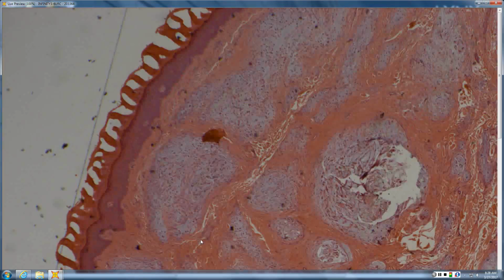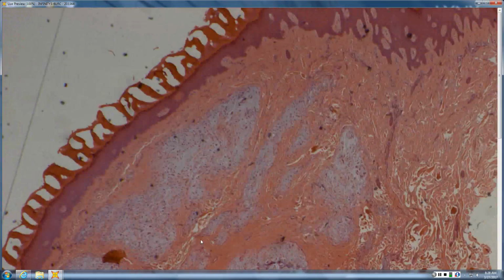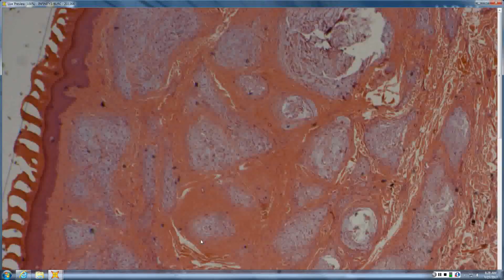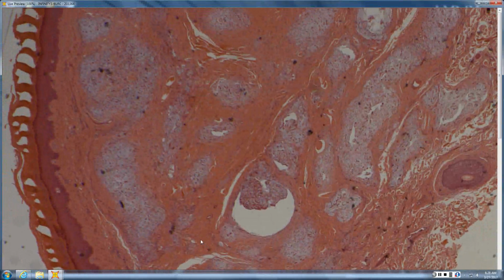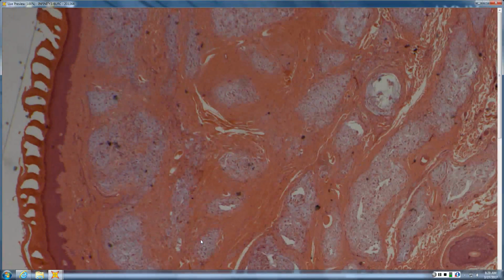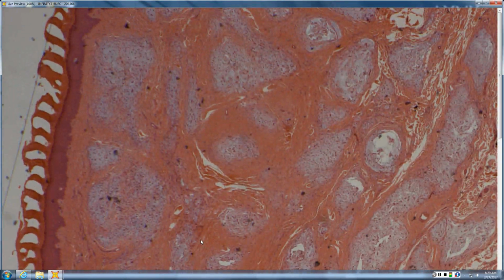Okay. How about this? What would give you these myxoid pools with stellate cells? Is it a nerve sheath myxoma? Yeah, nerve sheath myxoma, which is the same as a myxoid neurothekeoma. How would you expect it to stain? S100. And it also may do S100A6, may not. It's the cellular ones that do S100A6.